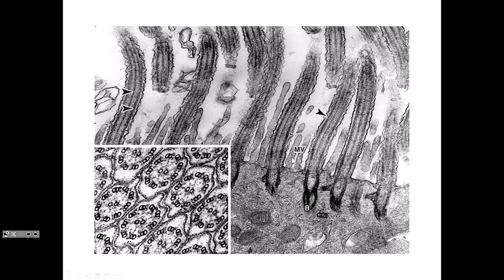So MV is little bits and pieces of microvilli, that brush border that we saw of the intestine, next to much wider diameter cilia. And the cilia, you can see, have these long, distinctive microtubules within them that you don't see in the microvilli. The microvilli are narrower.